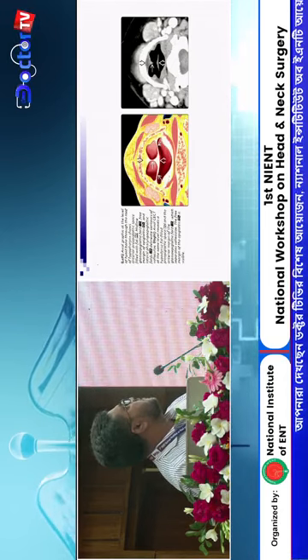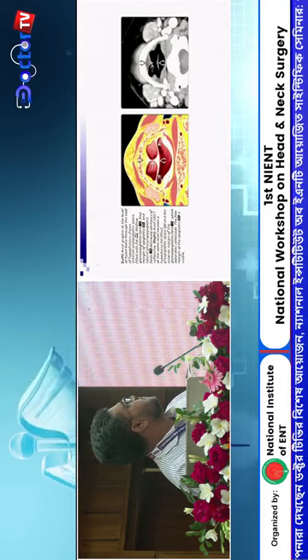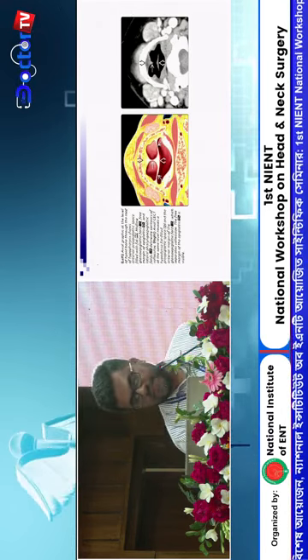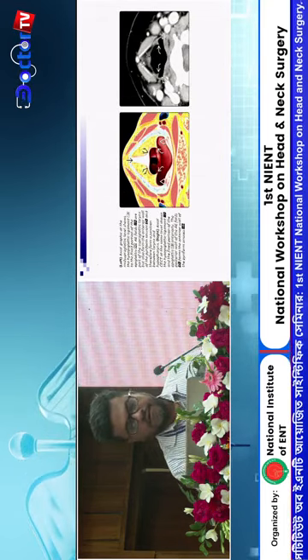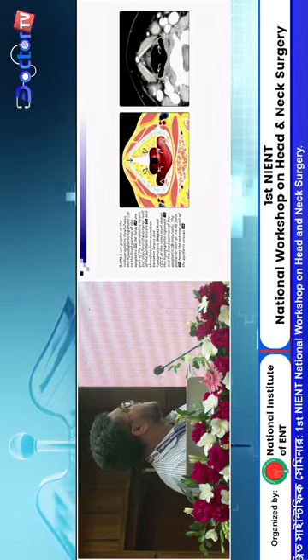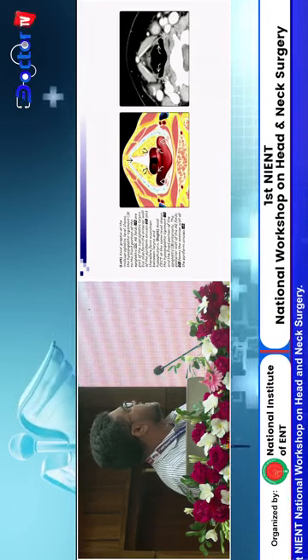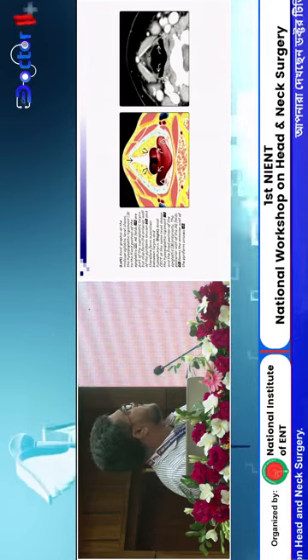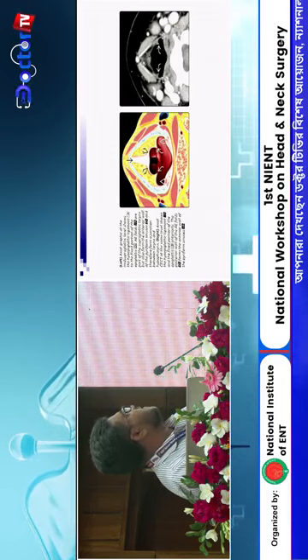This is the epiglottis. The midline structure is the median glossoepiglottic fold. This is the epiglottis free margin, supraglottic. Below this level, we also see the aryepiglottic fold starting to appear, the pyriform sinuses and posterior pharyngeal wall, and these areas are the pre-epiglottic space, and it is the fixed portion of the epiglottis at this level.